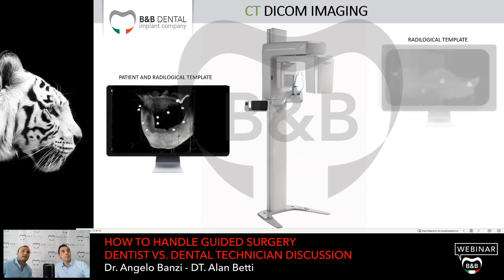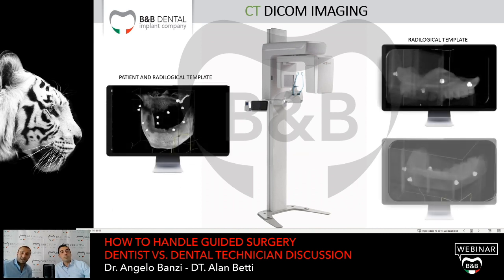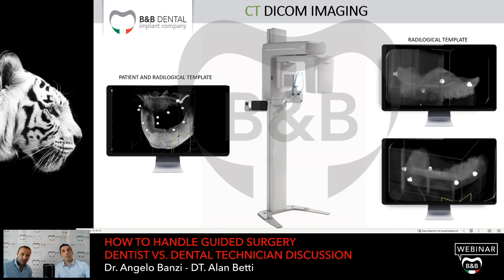So we can say that at the beginning we will start working with two DICOM exams. One is coming from the patient wearing the radiological template, and you can see in this view that the radiological template, because it's resin, you cannot see in these exams, but what you can see is the bone of the patient and the radiopaque marker. The most important thing in this case.